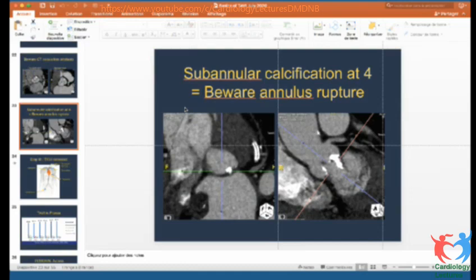7 years durability, but we began the experience with high-risk patients that were contraindicated for surgery, and I think we have to wait for intermediate and low-risk trials to have the durability of these patients included in these trials. For SAPIEN 3 they will follow the patients for 10 years. So I think we need good trials with patients at intermediate and low risk to check durability.